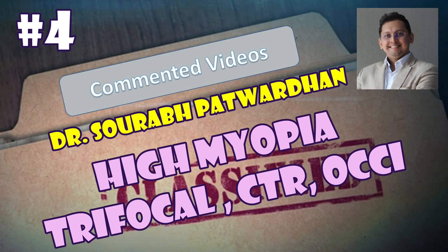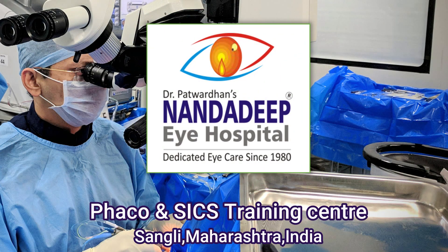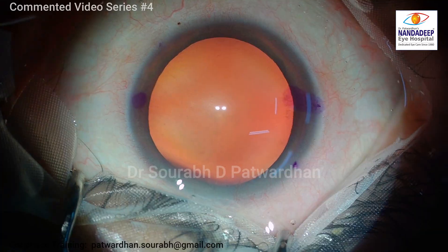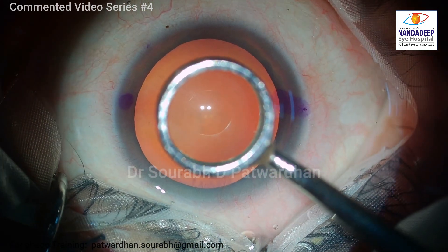Hello, this is Dr. Saurabh Patvadhan from Nanda Deepai Hospital and Pheco Training Center, India. This is commented video number 4. In this video, I will be speaking about a high myopia case and I am planning a trifocal IOL implantation.